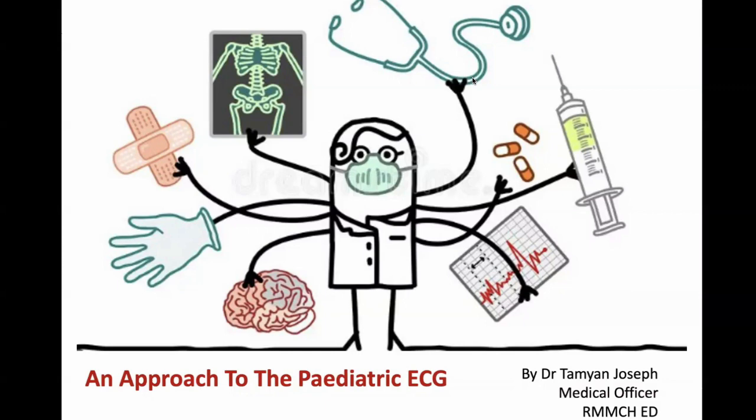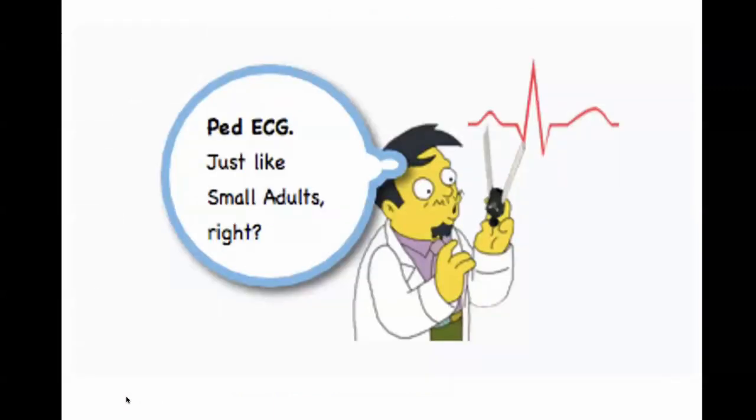There are several situations when the pediatric ECG is an integral part of the clinical evaluation. Such conditions include, and are not limited to, syncopal episodes, drownings, seizures, pericarditis, and chest pain. ECGs are definitely more commonly encountered when evaluating adult patients, and I think it's for this reason that the pediatric ECG can make doctors feel very uncomfortable. So just a little cartoon there.